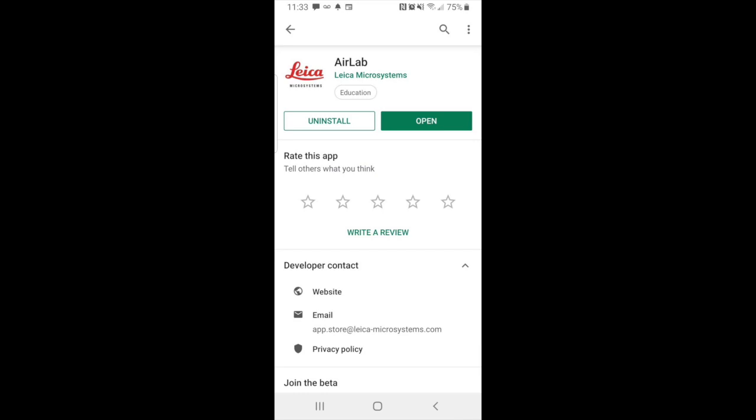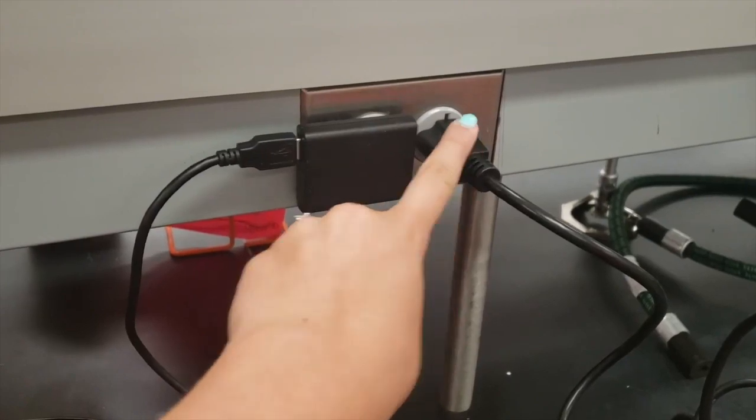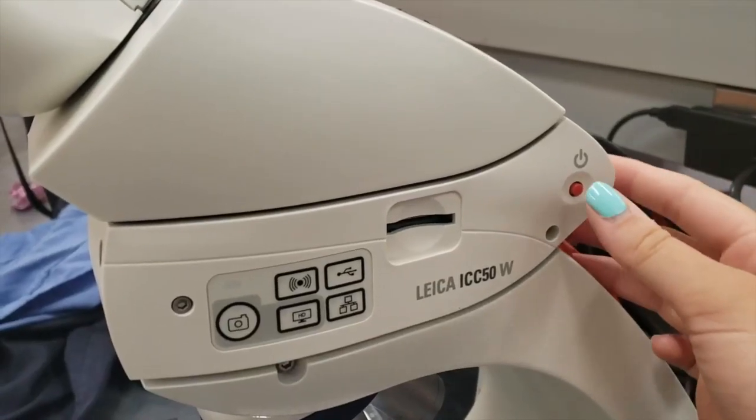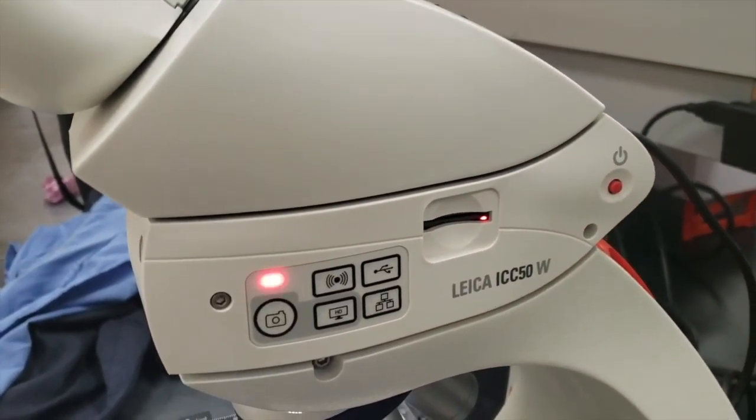Make sure the microscope is plugged in and working before you use it. Make sure the camera scope is also plugged into the outlets. To turn on the camera scope, you're going to press the red power button located here.